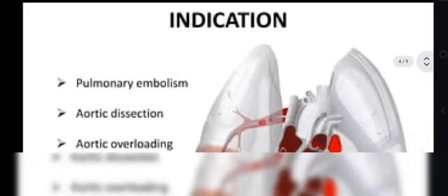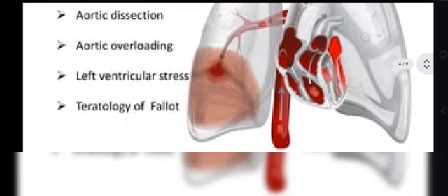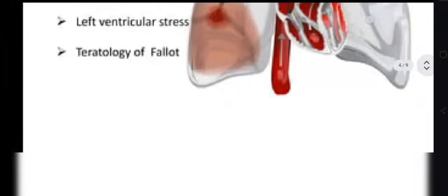So there are several indications. What are the indications? To diagnose pulmonary embolism, pulmonary artery aneurysm, aortic dissection, aortic overloading, left ventricular stress, tetralogy of Fallot, vascular malformations in the lungs, and tumors related to the blood supply.